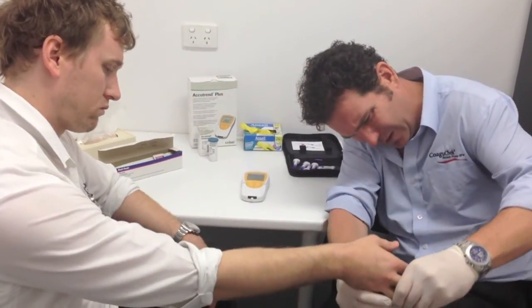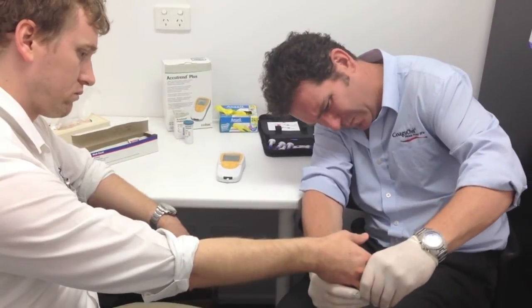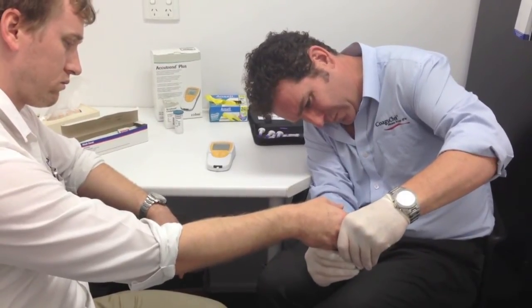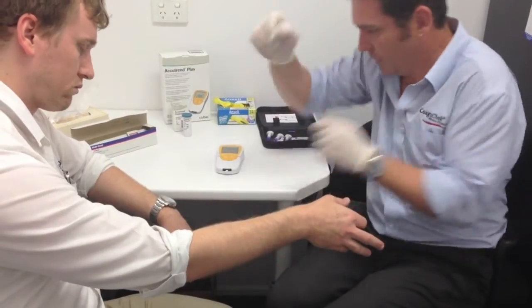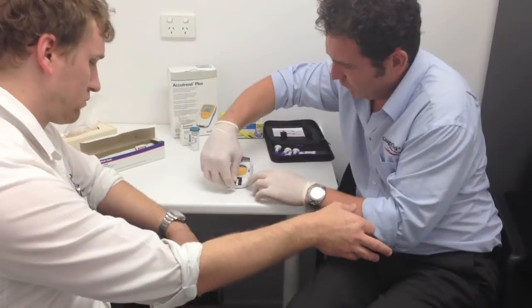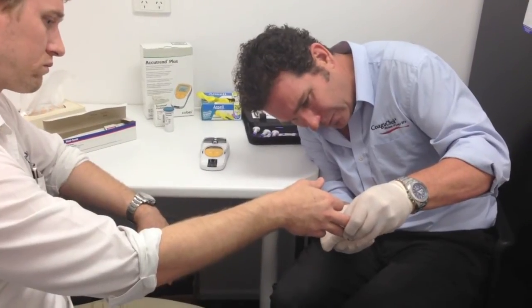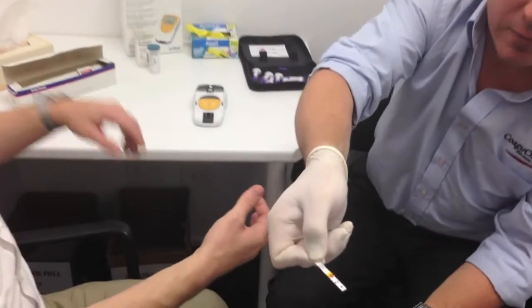Take it down like a hammer. There we go — just hold that there. So we lift the lid, withdraw the strip and collect the blood onto the strip. Beautiful — you can see that we've virtually covered the whole of the patch.